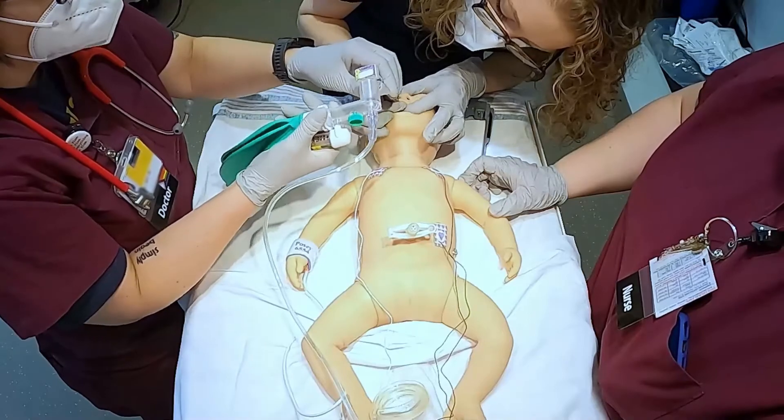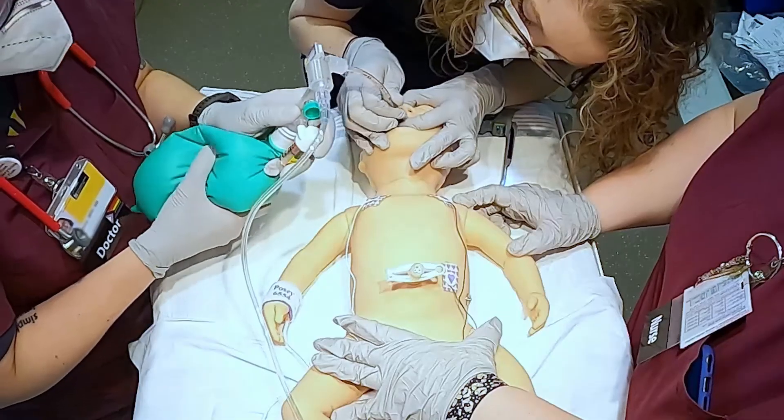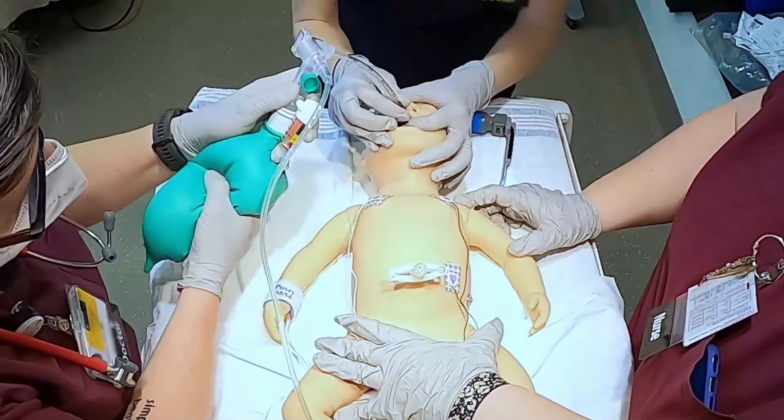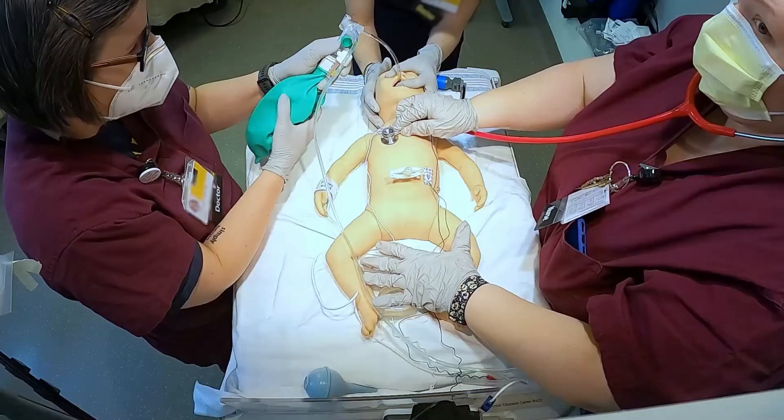Attach the CO2 detector and PPV device. The best indicators of proper placement are the presence of exhaled CO2 and a rising heart rate. Our heart rate is coming up.